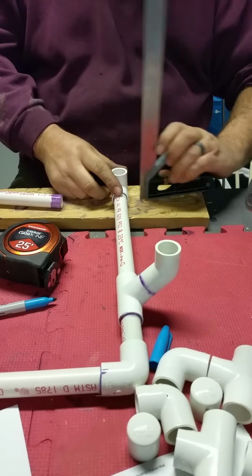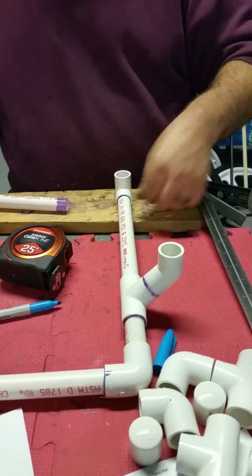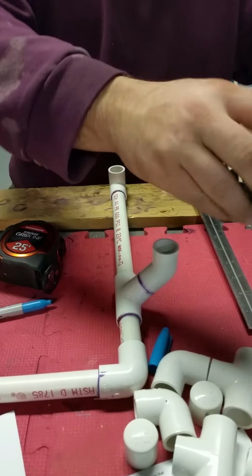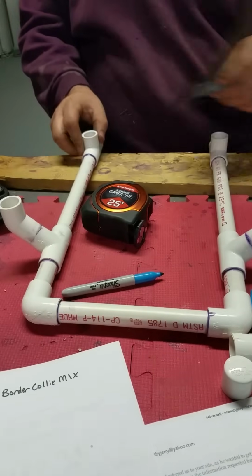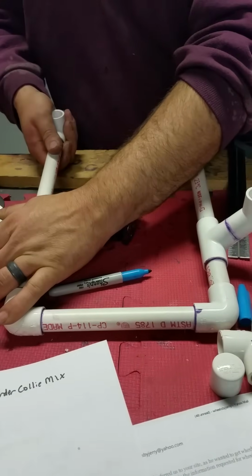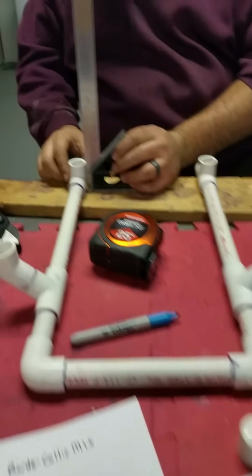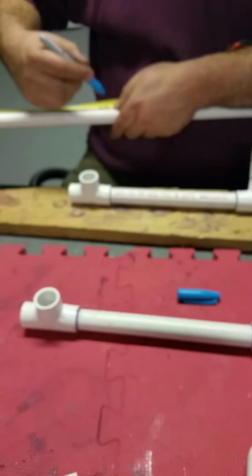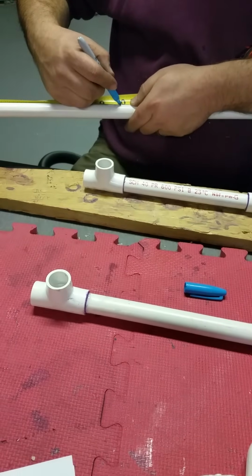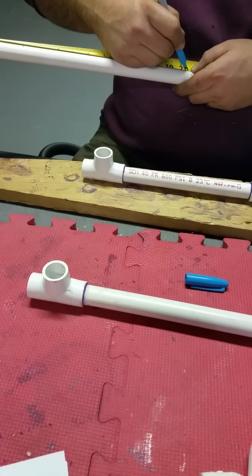It's just ever so fine of an adjustment to make it perfect. Well, as perfect as you can. You do one side at a time. So here we're measuring the 10 inches for the front part of the arms.